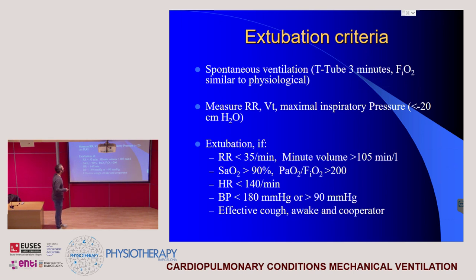So the first thing is to try to perform as closely as possible a spontaneous ventilation. It is called the T-tube test. In fact, during that test, the patient is without ventilation and just the tracheal tube remains, and the patient tries to breathe normally. It is very close to physiological respiration.